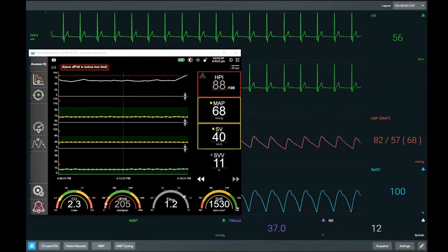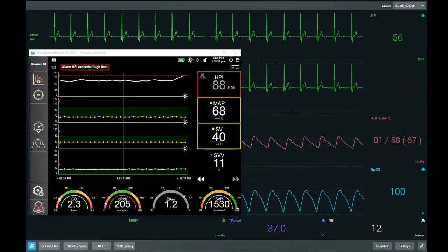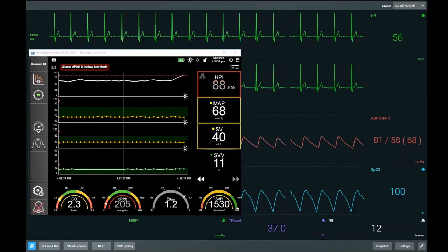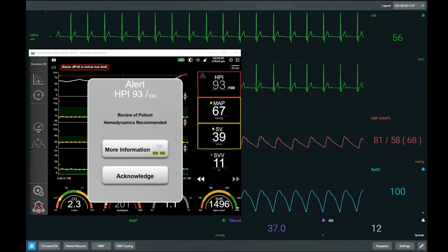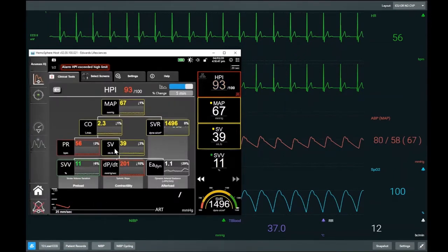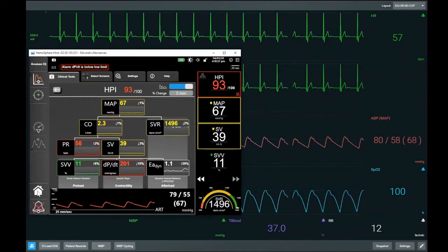As HPI gets higher, it implies more instability and we are much more likely to be trending towards a hypotensive event. This change in HPI — this Delta HPI — is our stimulus to look around, have some environmental awareness about what's going on, and to investigate the underlying physiology to see what is causing that increase in HPI. Once HPI gets above 85, it does alarm. Reviewing our physiology now, HPI is raised and we are trending towards hypotension.